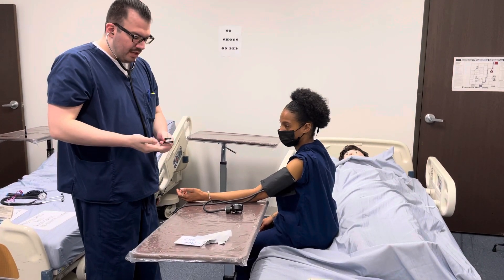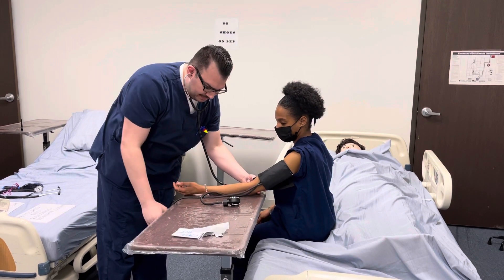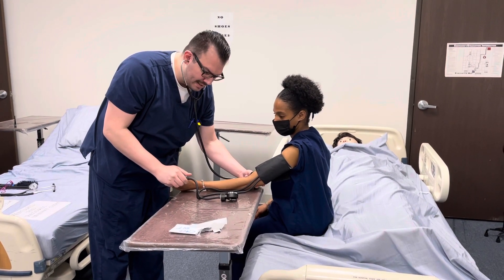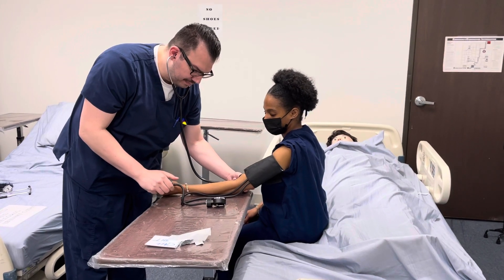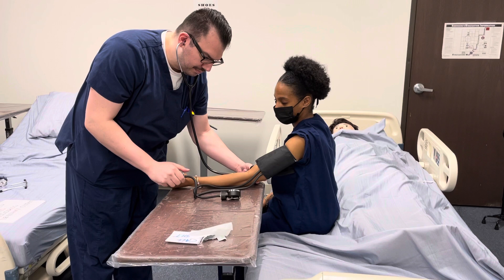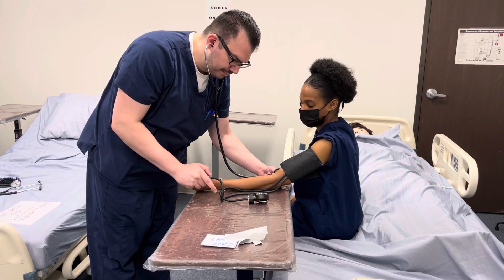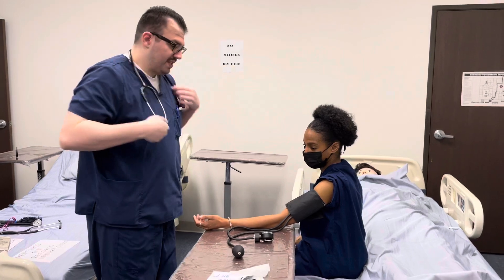I'll tap on the diaphragm of my stethoscope, also placing it over the brachial artery, and then I'm going to go ahead and pump up to between 160 and 180, listening for the first and the last sound. 112 over 68.